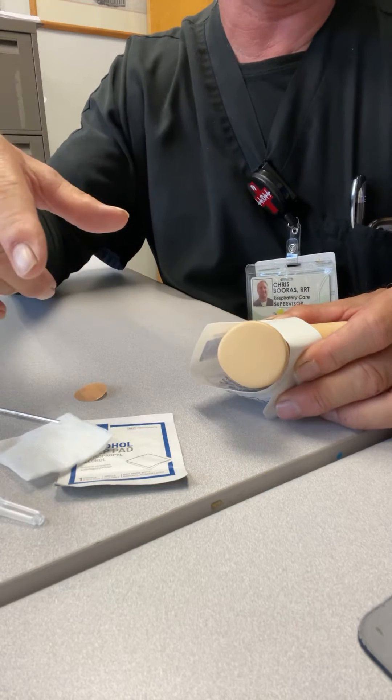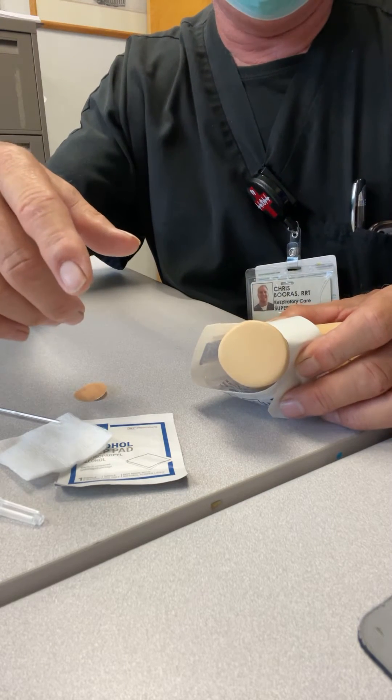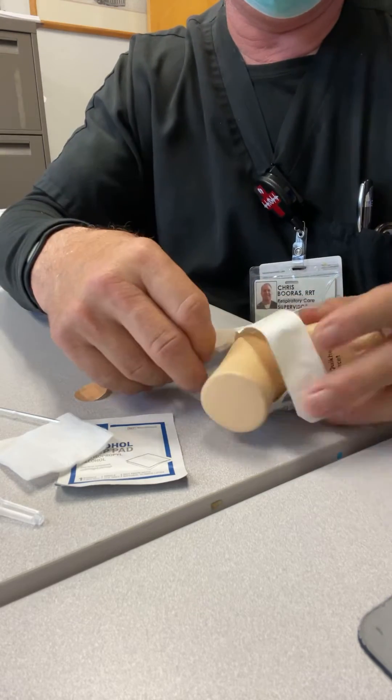You want it to warm at least five minutes to give the blood the time to arterialize. Once it's nice and warm, pull your heel warmer off.